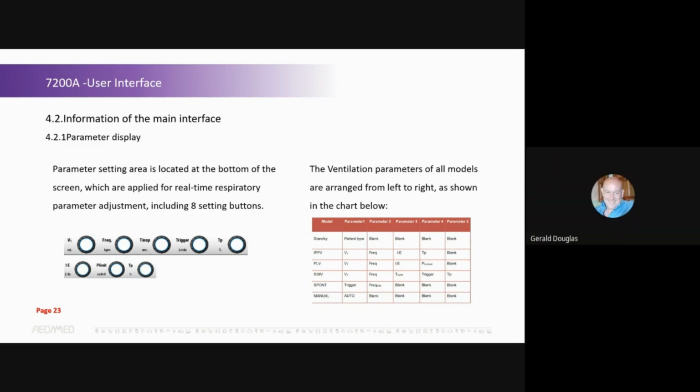So the ultrasonic sensor, I think, is also very accurate, and it can last for many years, 10 years or more, without replacement. So if we look at total cost of ownership, in 10 years you may pay for 5 electrochemical sensors, but you may never have to replace the ultrasonic one. So I'm not convinced on the cost argument, but on accuracy, I do not know.